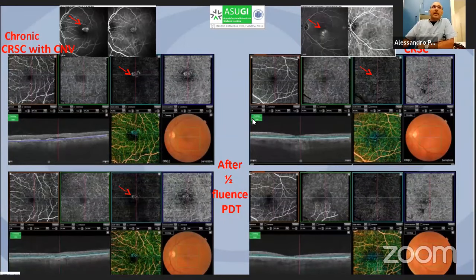What we can see in this period, in 2015, is two patients with central serous retinopathy, and we found out in the very beginning, 2015, that this kind of imaging was really helpful in these patients, because we can see some types of new neovascular membranes that before we couldn't appreciate so precisely.